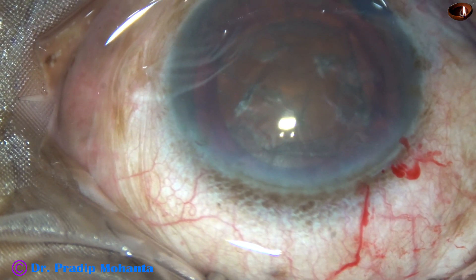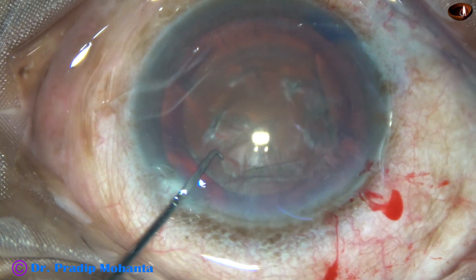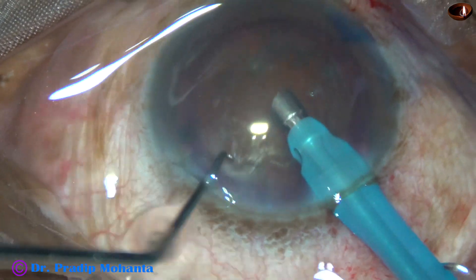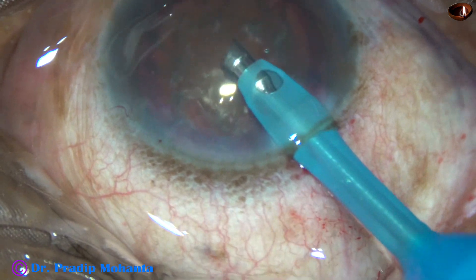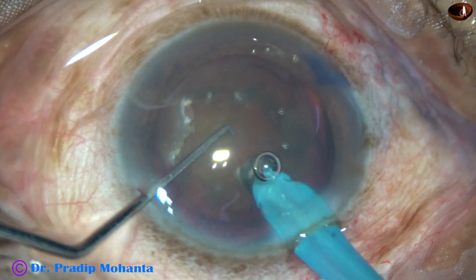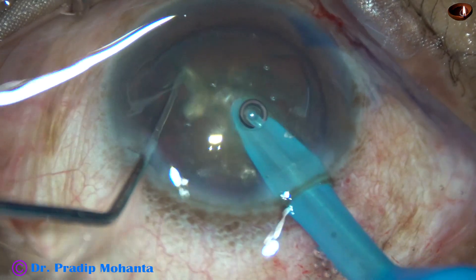And now I am going to try my technique which I call submarine chop. But the submarine chop didn't work in this case. The cataract is so hard and there was such a stubborn, leathery posterior plate that I could not separate the pieces. I have exposed the tip a bit more so that I can go inside the nucleus. The tip is travelling through the nucleus towards the opposite equator. And this is a nice crack.